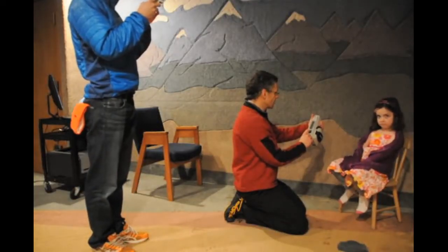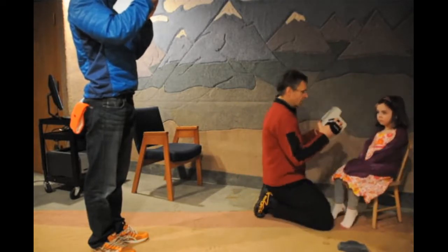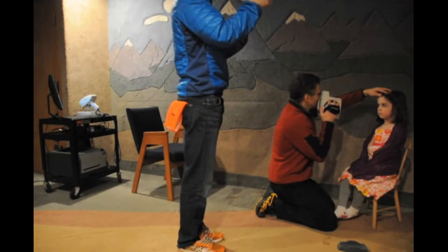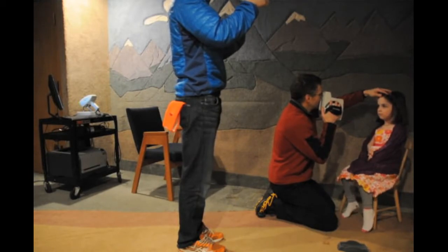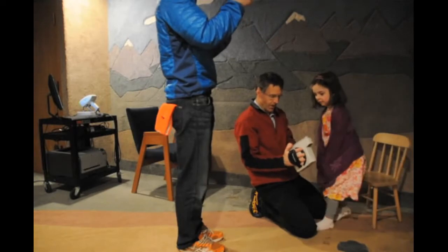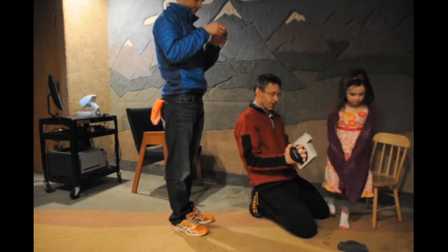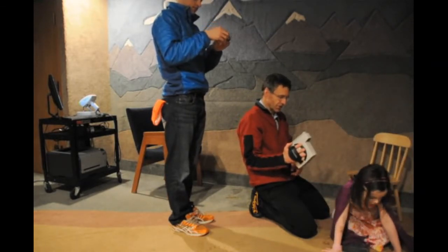We're going to let it pretend that you're little, okay, so I turned it on to little. Now you get to take a look just like this. Did it sing a little bit? You guessed what you have — well, we'll have to find out. Now we have to send the information to that little printer right there, and the little printer thinks you have it set to little.